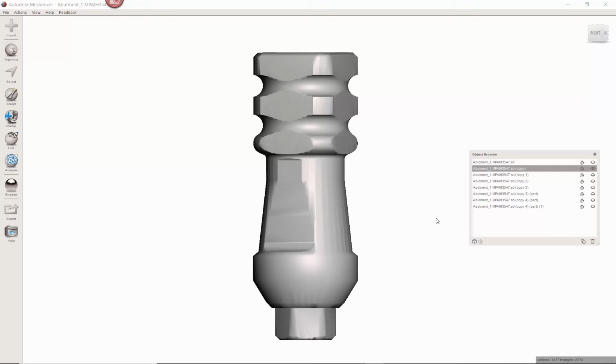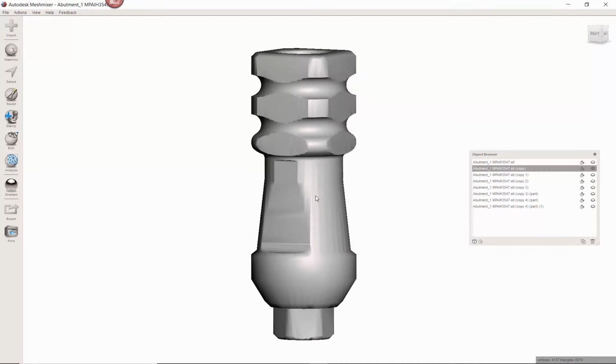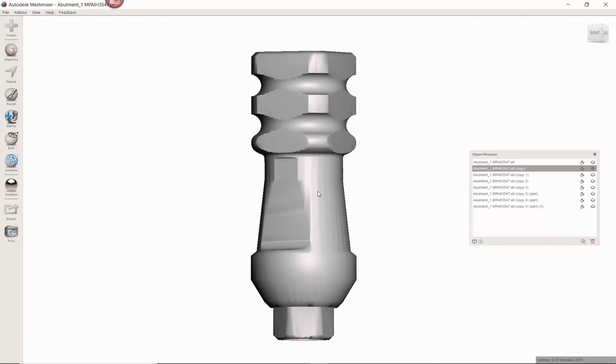Okay, so in this video, I'm going to show you how to generate an abutment in the software for an abutment that you have in your hand, but you don't have a digital file of. Now, in this case, I am going to be using a digital file, but I'm going to try to use this way of showing what I would do in real life.